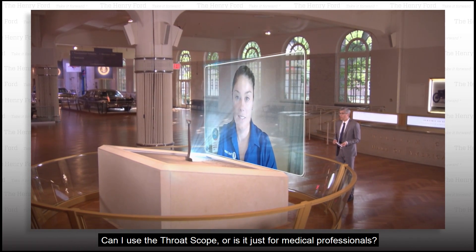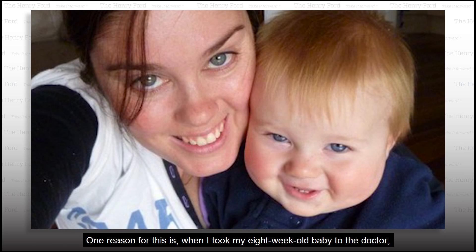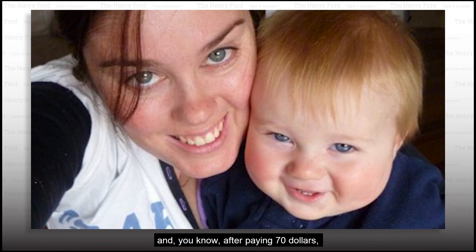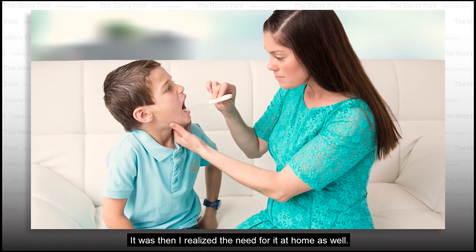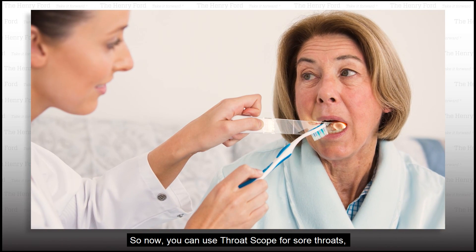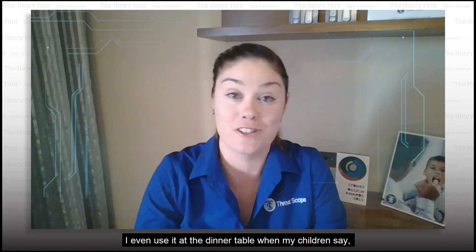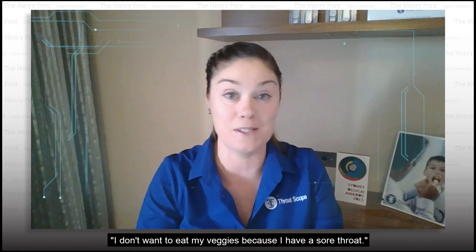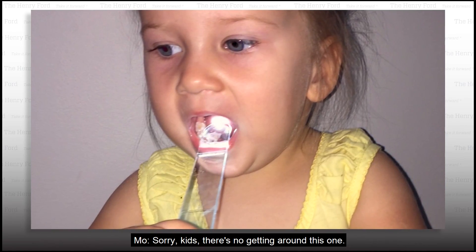Can I use the Throat Scope, or is it just for medical professionals? Throat Scope isn't just for doctors — it is also available for in-home use. One reason for this is when I took my eight-week-old baby to the doctor and, after paying $70, I walked out and the doctor said, he's got a new tooth. It was then I realised the need for it at home as well. So now you can use Throat Scope for sore throats, mouth ulcers, gum infections. I even use it at the dinner table when my children say they don't want to eat their veggies because they have a sore throat — so now you can have a look for yourself. Sorry kids, there's no getting around this one.